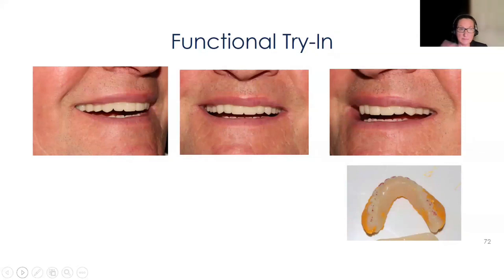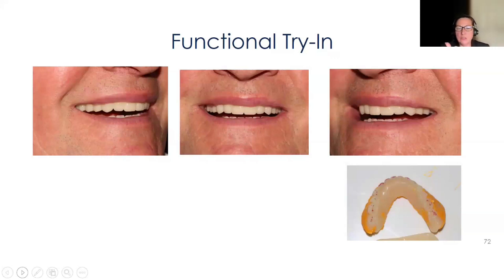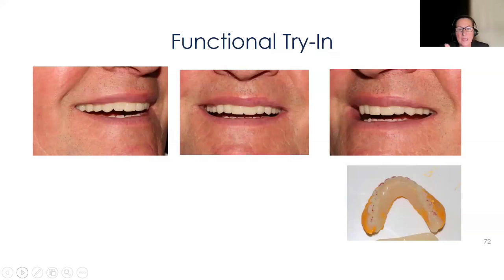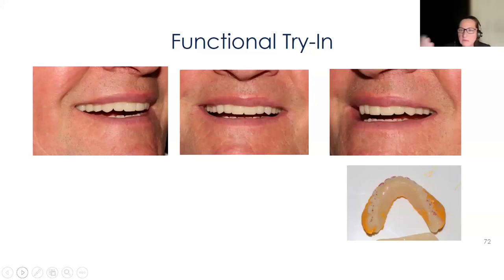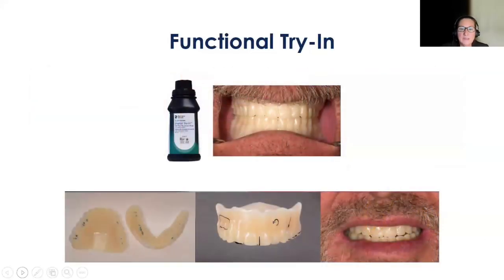Here is the functional try-in. Treat this almost like delivering a denture: PIP paste, check their bite, check their midline. If you want anything changed, you can use a Sharpie — but use a thin enough one — or just describe it verbally, such as 'move number eight a half millimeter to the mesial' or 'bring eight and nine down.' You can also add composite to show desired tooth length, or remove with an acrylic bur if you want them shorter. Here's where a patient wanted a slight rotation — that's your functional try-in feedback.